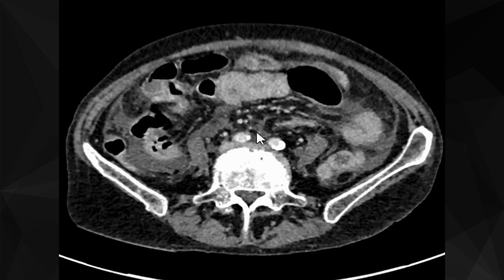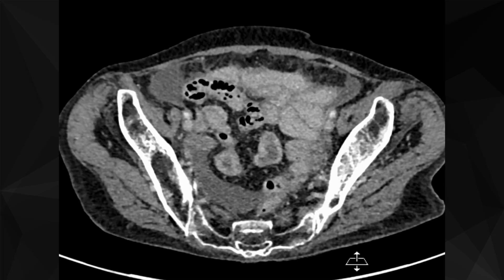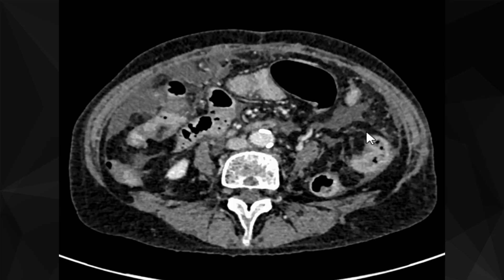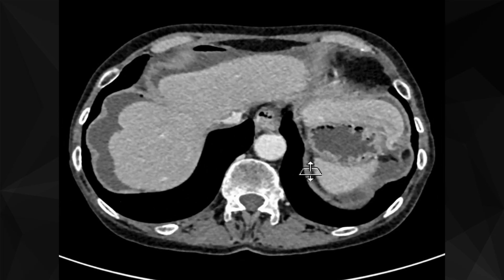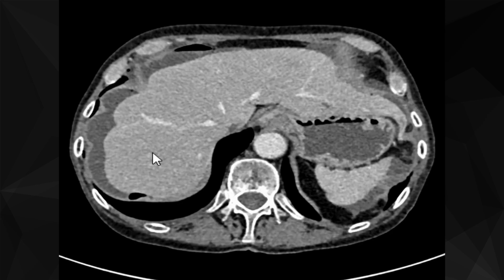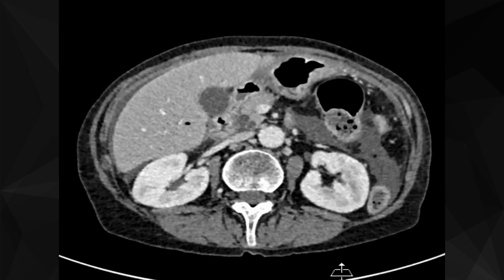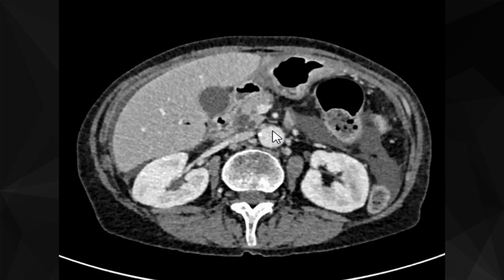The bowel loops do not appear obstructed — they all appear normal in caliber. Now let's go back to the upper abdomen around the liver. You can see some gas loculi around the hepatic surface, forming air-fluid levels. There are some further gas loculi at the liver hilum.